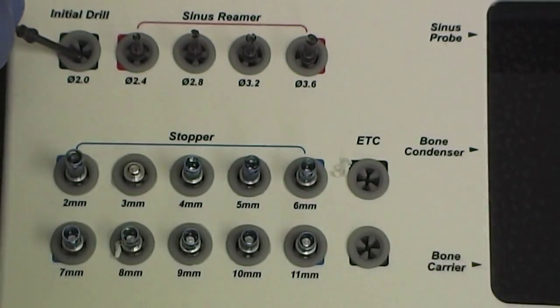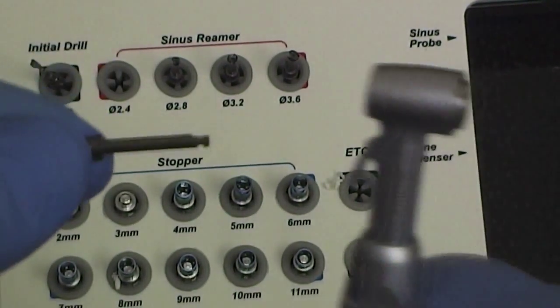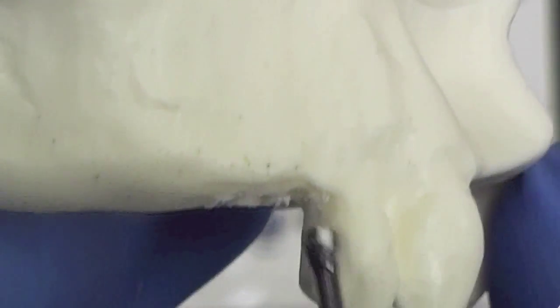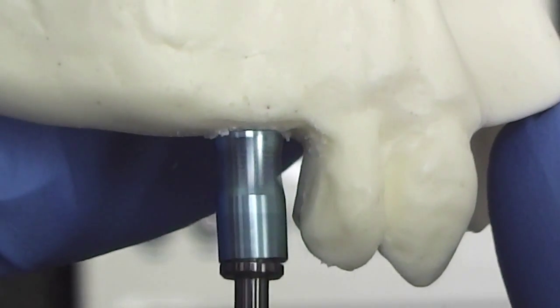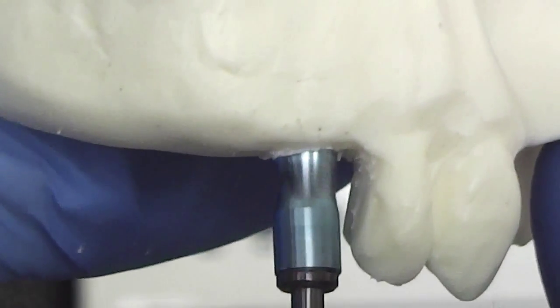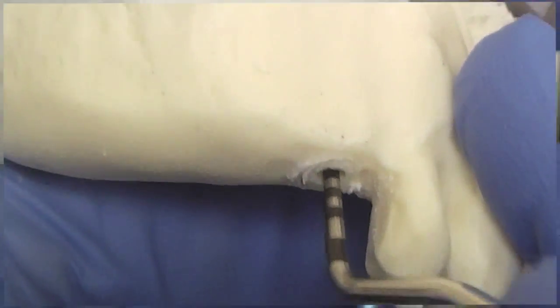So what I'm going to do is replace the 2 millimeter regular osteotomy burr, and I'm going to take the 2.4 out. I'm going to load it into the Blue Sky Bio handpiece. Okay, here is the 8 millimeter stopper in place. We have a millimeter to go. Again, our depth stop prevents us from going any deeper. We check with the sinus probe using the appropriate diameter, and we're still solid and haven't lifted the membrane yet.